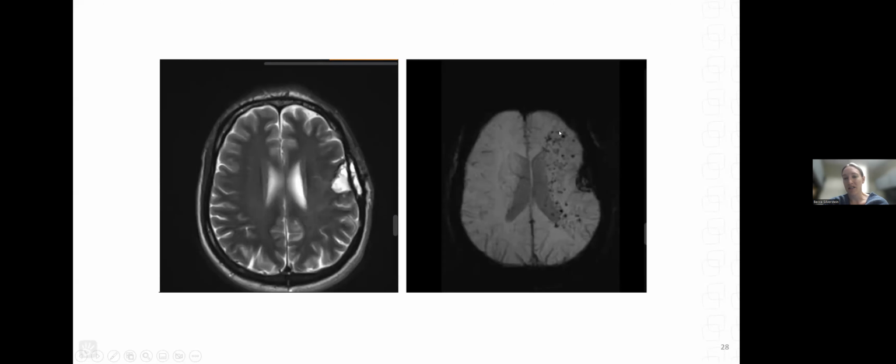These may represent post-op radiation changes or just destruction to the tissue itself. So these are all blood products right here surrounding that post-radiation site. So it's pretty amazing what you can see compared to what you can't see on a T2 image or other images.